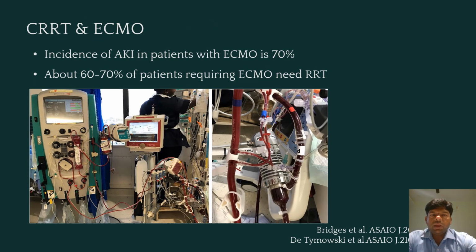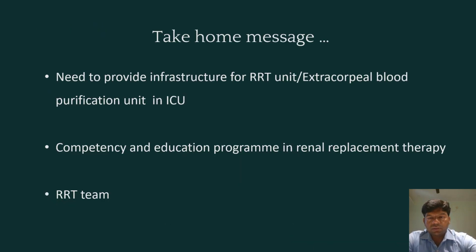And the incidence of AKI in patients with ECMO is very high, 70%. So about 60 to 70% of patients requiring ECMO need RRT. So whenever you are planning for ECMO, you should have the CRRT machine on standby.